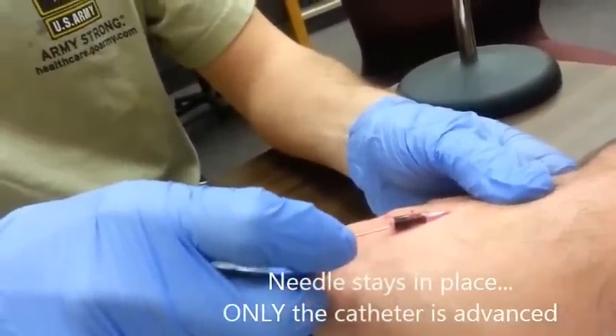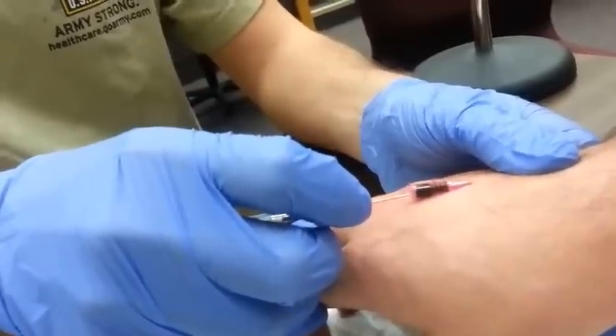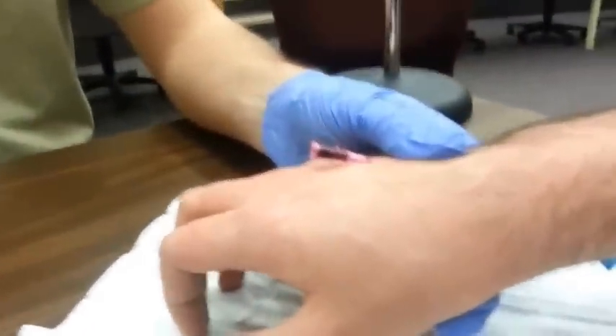We are simply sliding the tubing off the needle. After you advance the catheter all the way up to the skin, you can remove the needle. Some needles, like the one here, are spring loaded so they will retract with a simple button push.